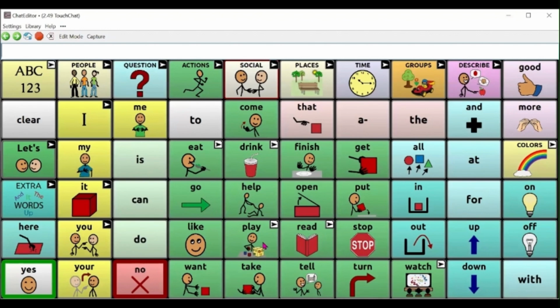And in the beginning, we want them to explore on their device. Exploring is actually really important for them. We want them to be able to say eat, eat, eat, and that's okay in the beginning. But we also need to respond, oh, you're telling me I want to eat, and then maybe present them with options so that they can learn that their words have power over time.